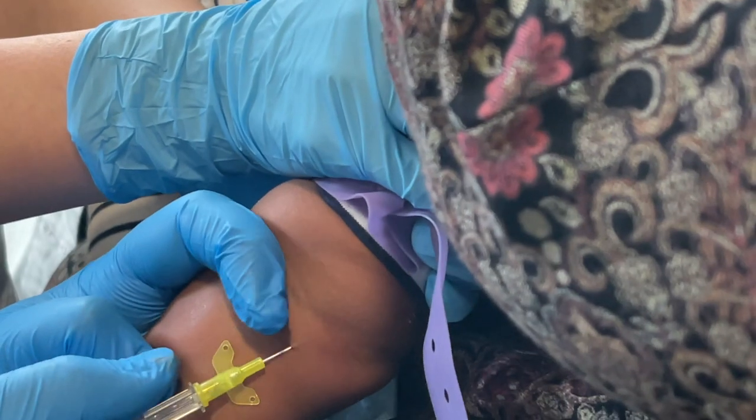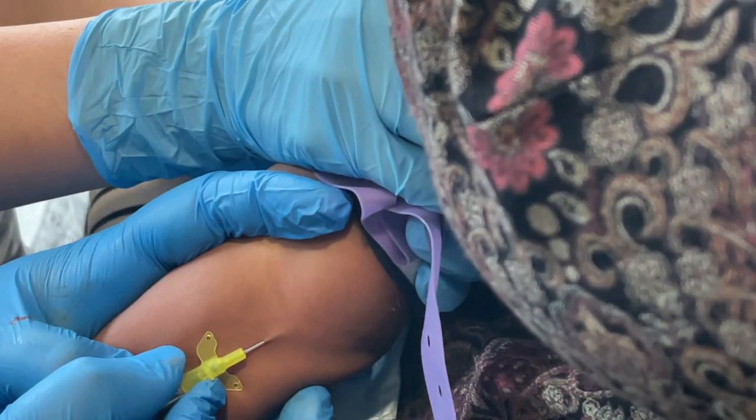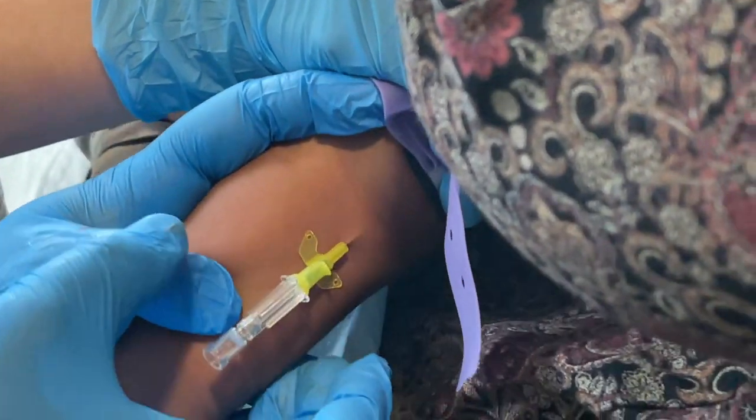If you have good ultrasound skills you could try to find an antecubital fossa vein in a chubby toddler, but more likely in younger children you're going to be looking at the back of the hand. The antecubital fossa can be an option in older children or young adults, but it should really be a last resort as it restricts movement and fails more frequently.